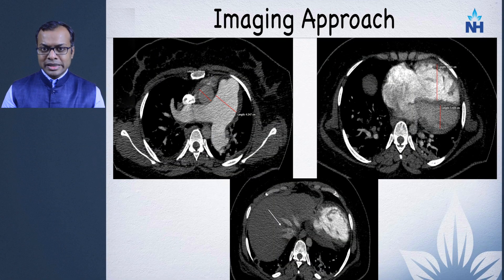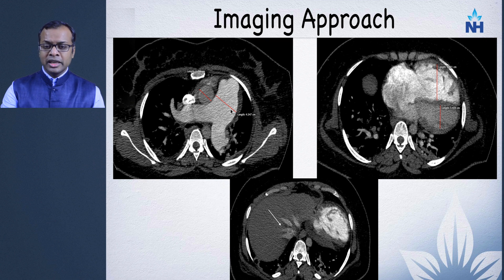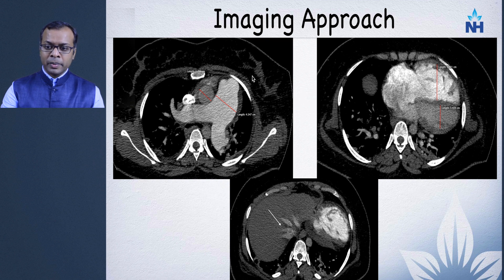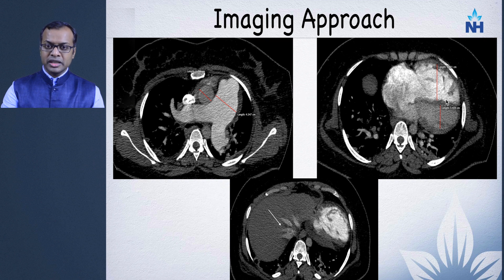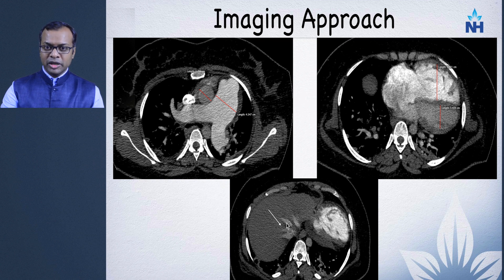On CT with suspected pulmonary hypertension, first look at the size of the pulmonary artery — larger than 2.9 cm, or the main pulmonary artery being larger than the aorta, is suspicious. Look at the right ventricle relative to the left ventricle — the RV should not be larger and the interventricular septum should not be straight. Reflux of contrast into the hepatic veins suggests tricuspid regurgitation, another feature of pulmonary hypertension.